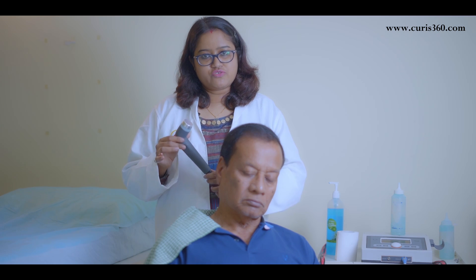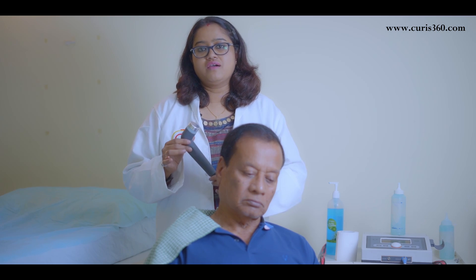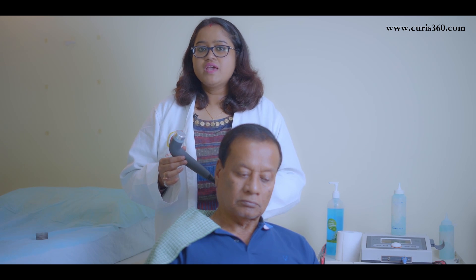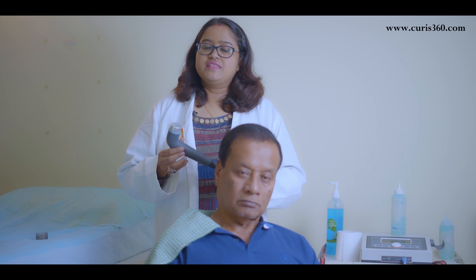There is absolutely no side effect from this ultrasound if it is used by a certified physiotherapist. A patient may not feel any sensation while performing ultrasound on them, as it produces sound waves which cannot be felt — these sound waves are above our hearing capacity, so we can't even hear them.